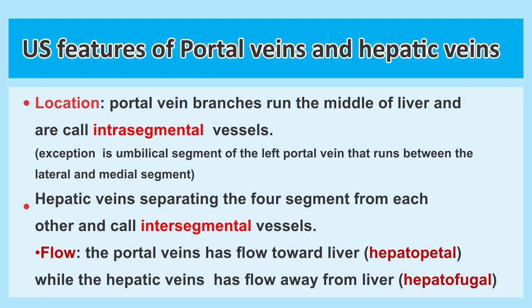The last characteristic is flow. The portal vein has flow toward the liver, which is called hepatopetal flow, while the hepatic veins have flow away from the liver, which is also called hepatofugal.